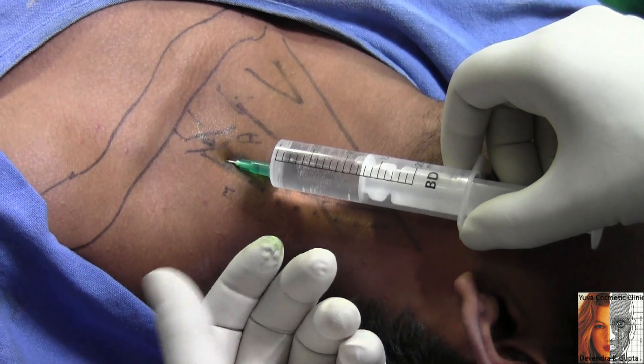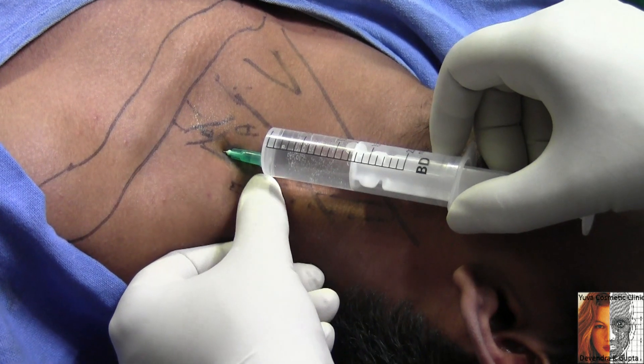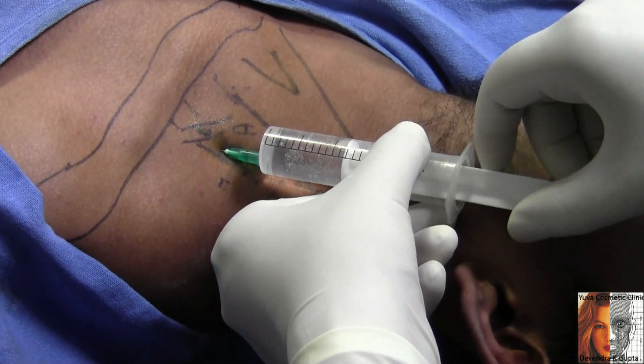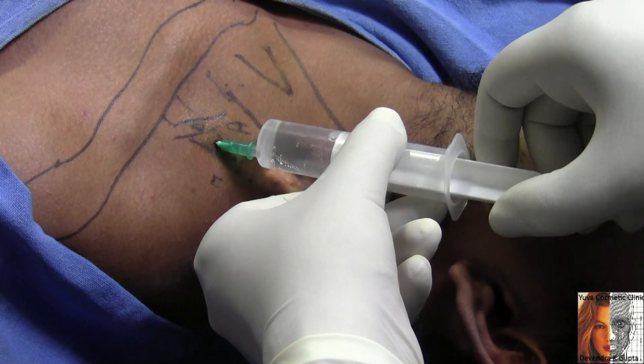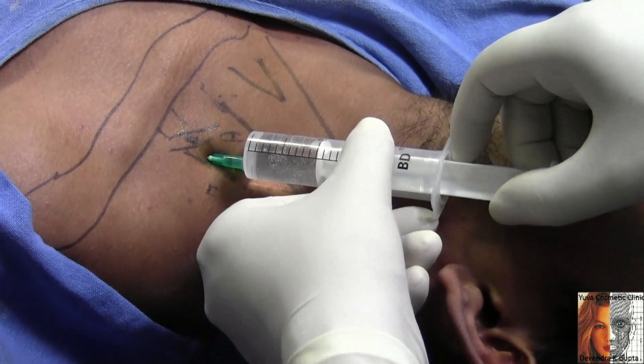I have created the space and then gently advance, advance, advance, and then inject. Then inject, aspirate, then inject, rotate, inject, rotate, inject, aspirate, then inject.